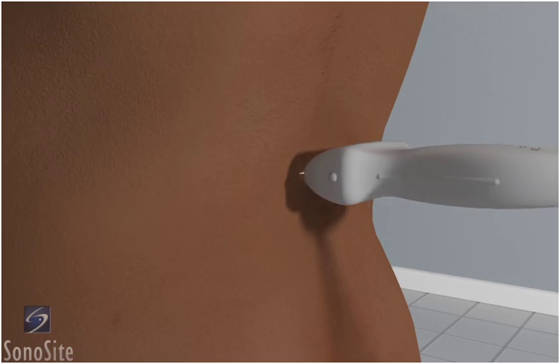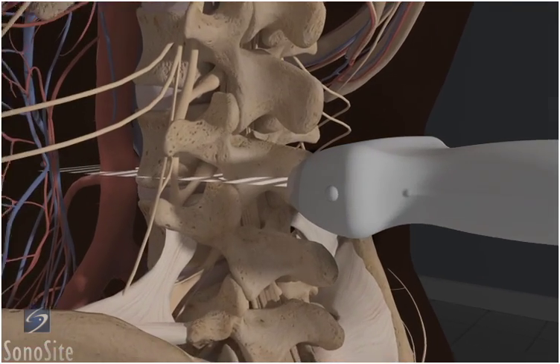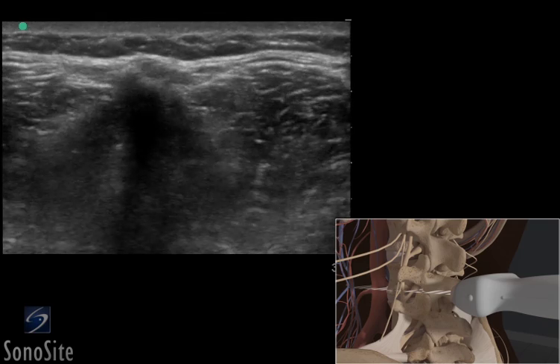The transducer is placed in a transverse direction with the orientation marker directed toward the patient's left side in the middle of the back at the level of the iliac crests. The spinous processes will appear as distinct hyperechoic peaks with acoustic shadowing below and define the midline of the spine.